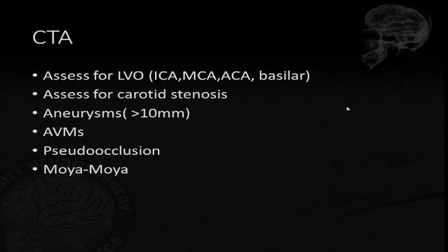Quick question on the assessment for carotid stenosis. There's a neurologist here, I think he's a recent hire. He wanted us to give him a specific or a more defined carotid stenosis percentage. So he wanted us to give him the NASCET, using the NASCET criteria, but in order to do that, he wanted us to do the curved reformat. So that takes a lot of time for us to do while we're on call. No, you go to the AW and you do it in the AW. It's easy.